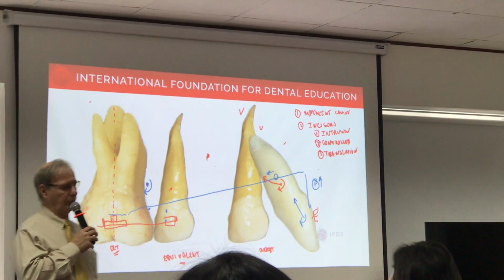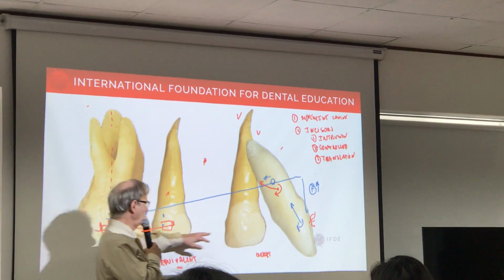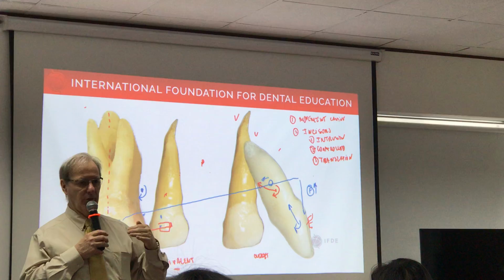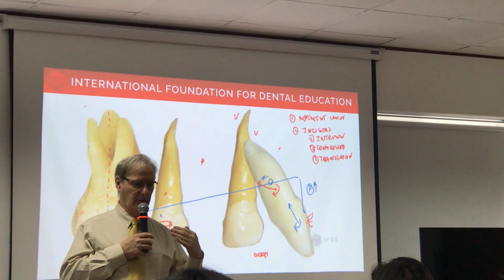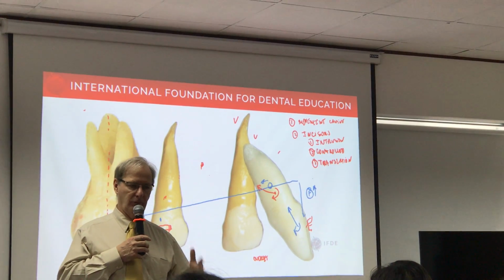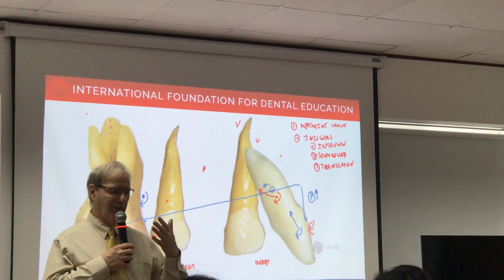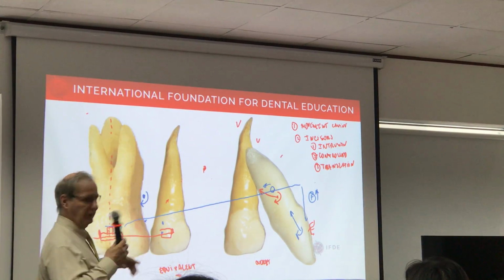And that's what I do for Dr. Nelson, with power arms, and usually I'm going to go a bit forward. It's pretty rare that you need absolute 100%. If you need absolute 100%, probably microimplants. But usually you can let the molars come forward a little bit, okay?